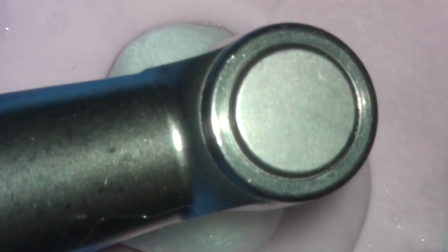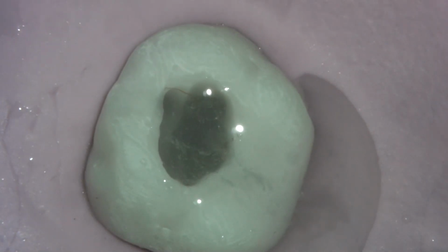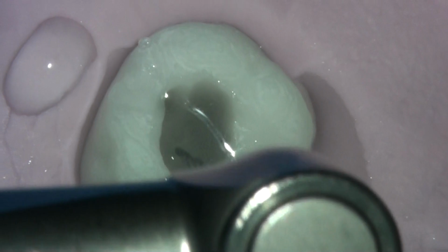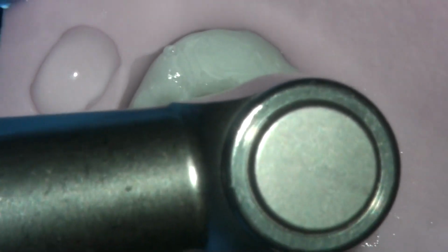But now we go back in and again we introduce it down in this canal. We aren't going to do it in one pass because again it's quite a tortuous anatomy that's there. So we go in, we re-irrigate, and we re-establish patency, we irrigate again, and we finally introduce in our finishing file, and we put that down to our full working length.